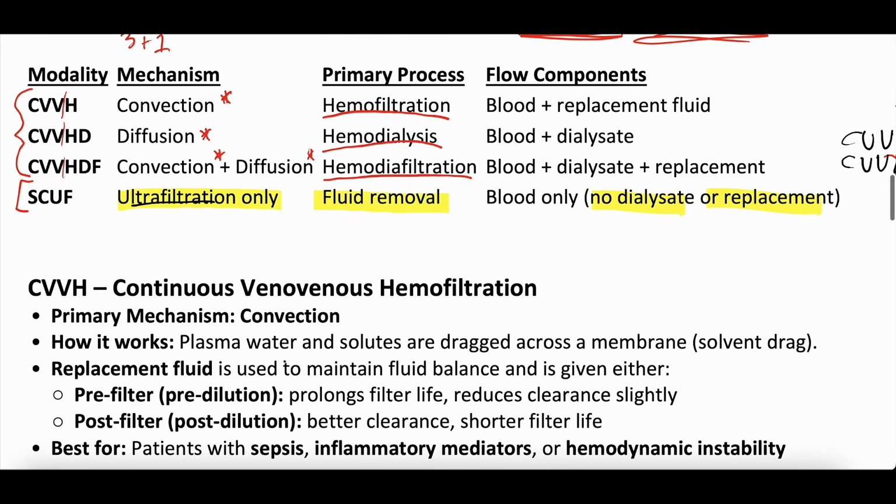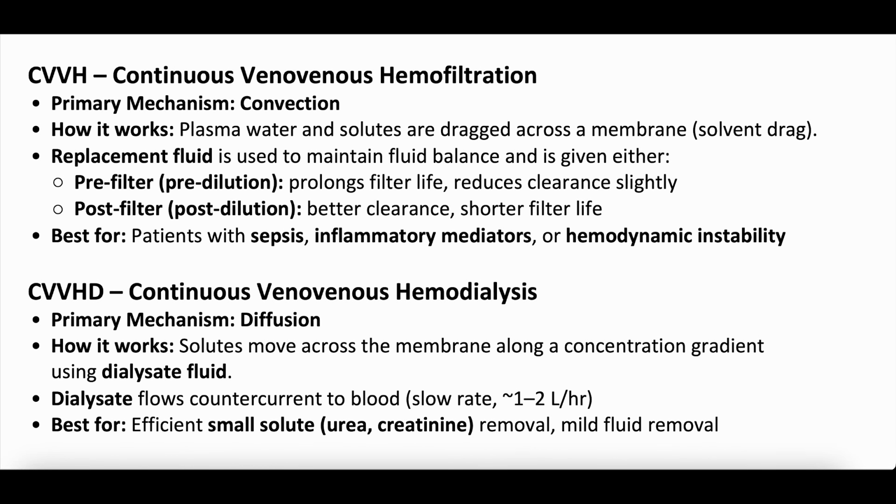All right, let's go into these modalities a little bit more, starting with CVVH. And even though CVVH would be nice if it was CVVHF, it is not, but it stands for continuous veno-venous hemofiltration, right?